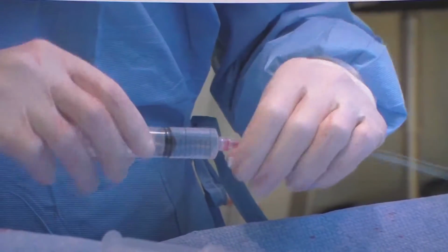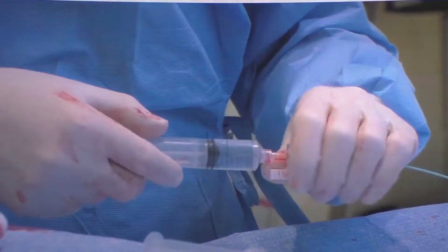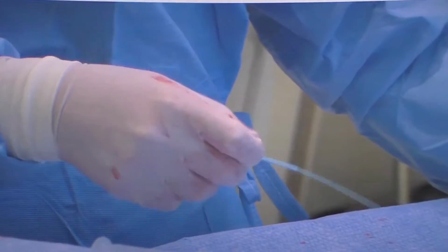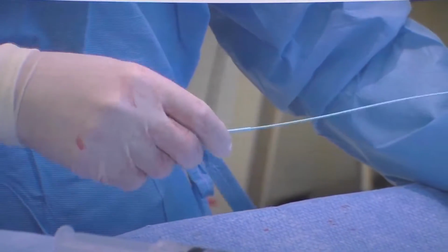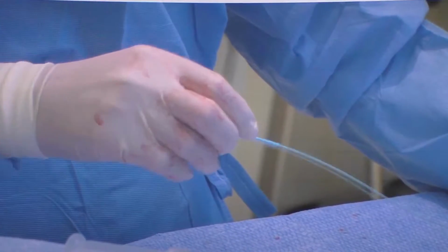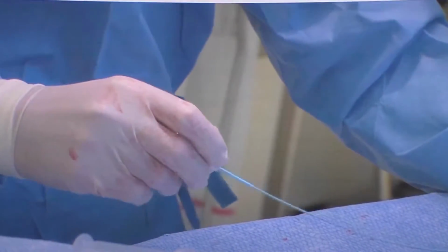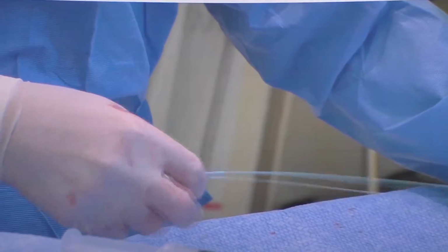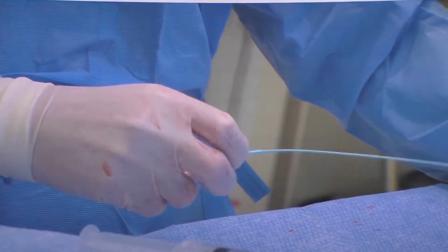Can we just get a close-up? That's the catheter, and the sound's gone. Your interpreter is very sorry. So the image is without any color, he seems to be saying, and I can control the catheter in order to get into the superior mesenteric artery or the celiac trunk.